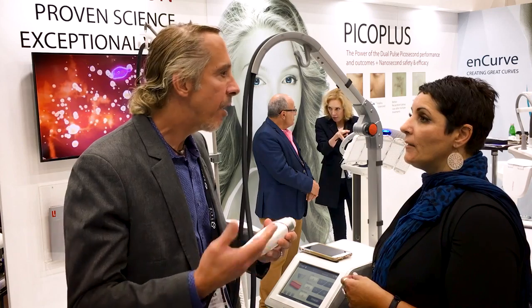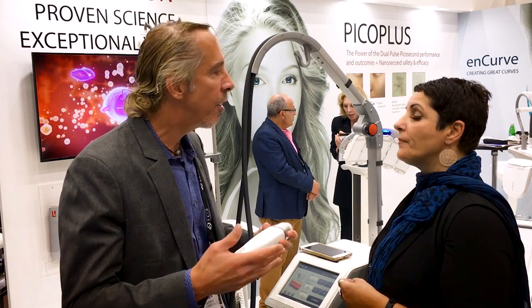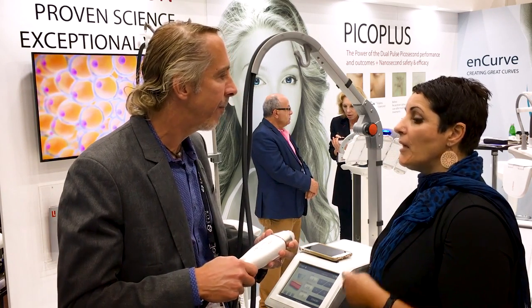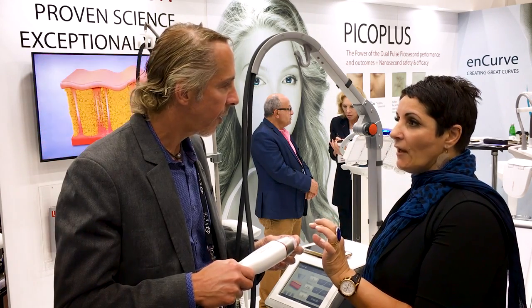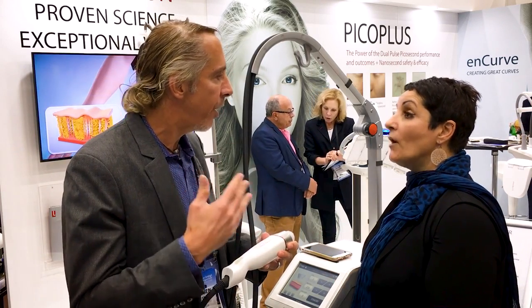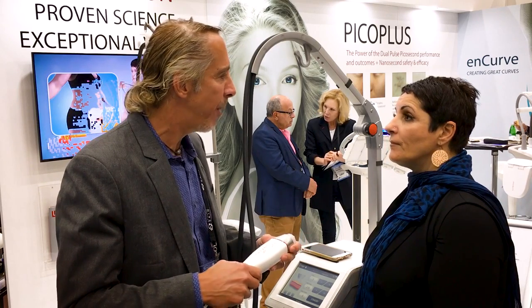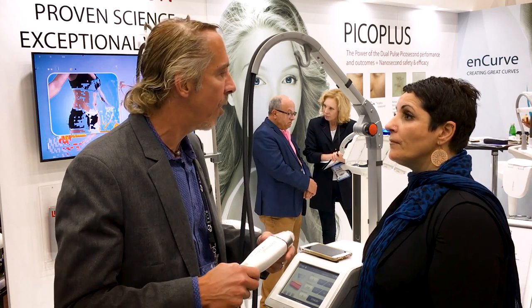It's about a 45-minute procedure, 35 minutes to do the face. And there's about a day to 3 days of some mild redness and swelling. Does it hurt? Is the big question. We usually just use topical anesthesia, numbing cream, and that takes care of about 95% of patients. Other patients require a little injection to make them more comfortable.